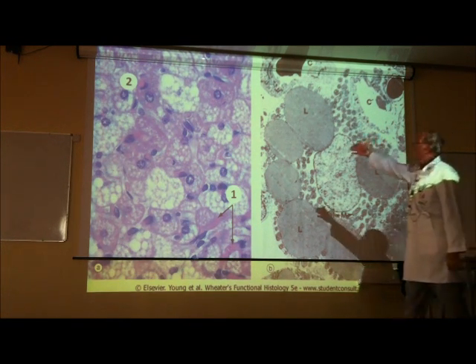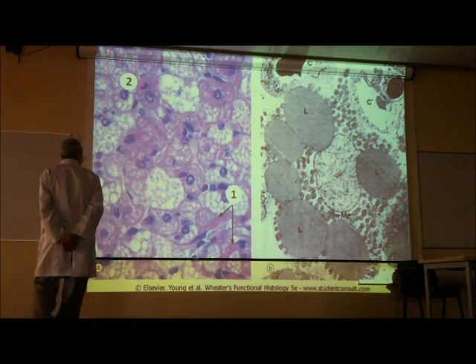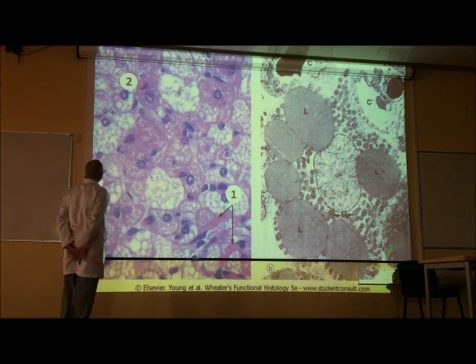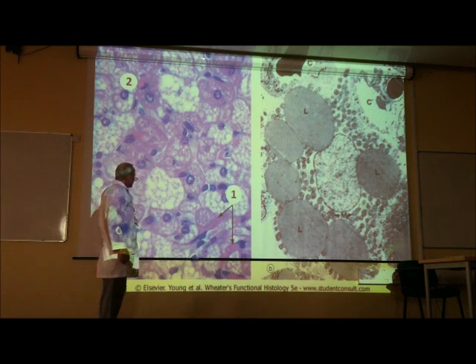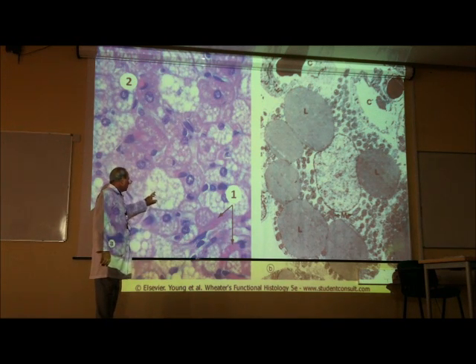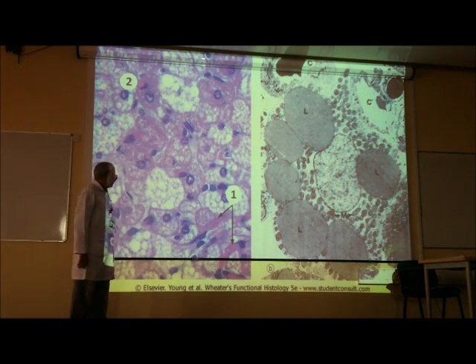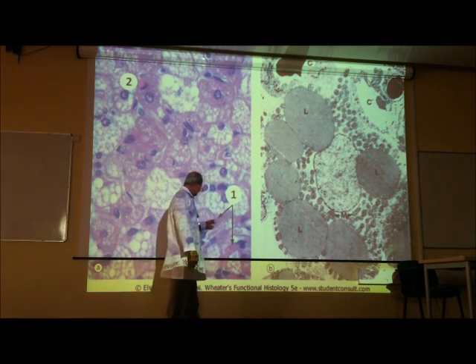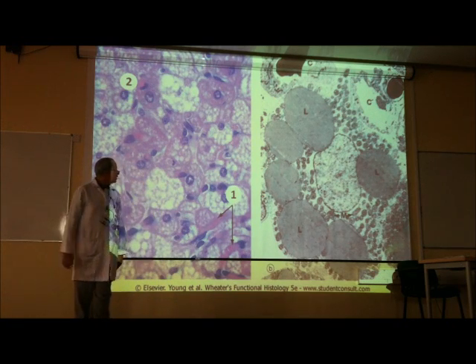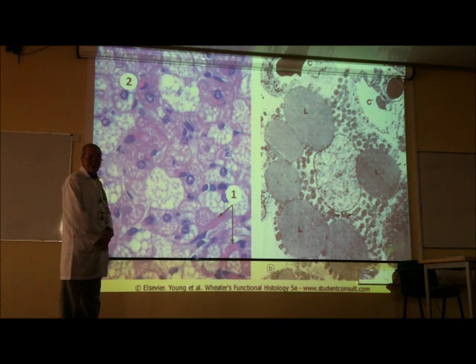Okay. What is the type of this tissue? Cells containing central nuclei. They have multiple dissolved lipid droplets. This tissue is more vascular, rich in blood capillaries. What do you think? Brown adipose tissue.